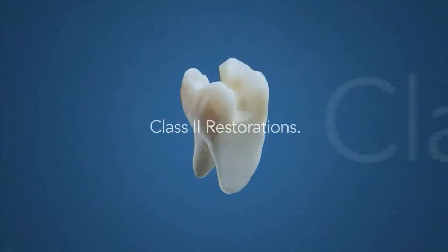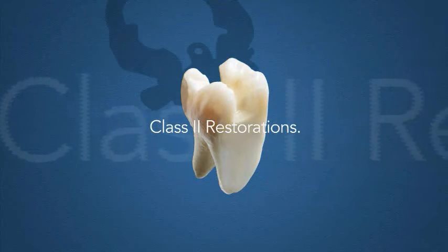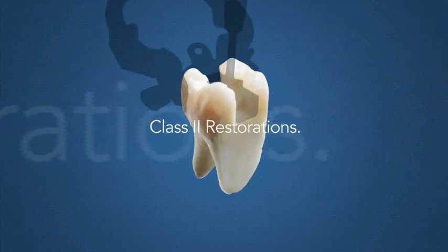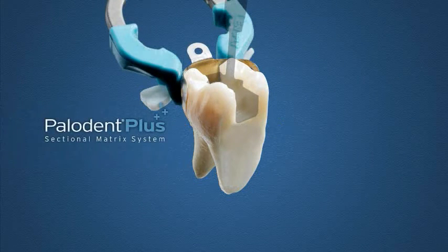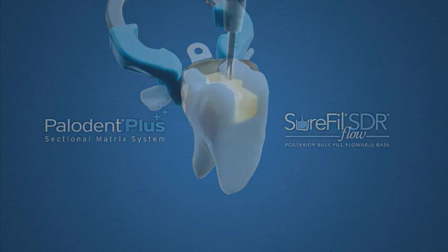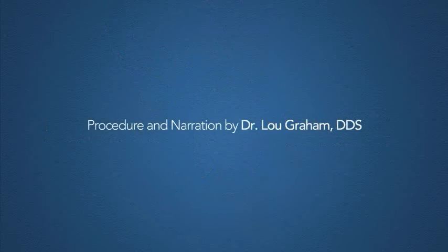When performing a Class II restoration, the unique combination of two notable products from Dentsply Caulk gives you a significant degree of control over the results. Palodent Plus, with its cutting-edge design based on tried-and-true technology from the original Palodent system, and Surefil SDR Flow, a new generation of bulk fill flowables, and one of the most successful product launches in Dentsply Caulk's history. Why do they make such a good team? Let's watch a Class II procedure performed and described by Dr. Lou Graham.